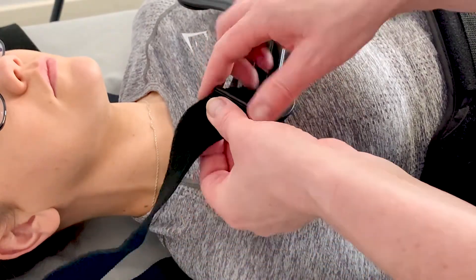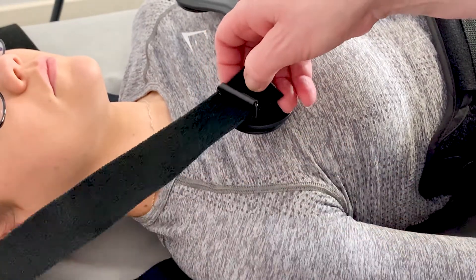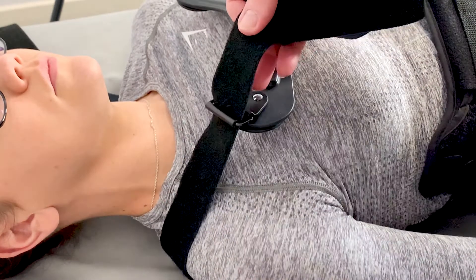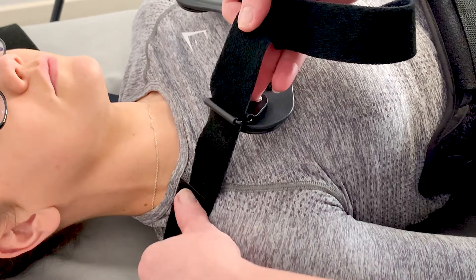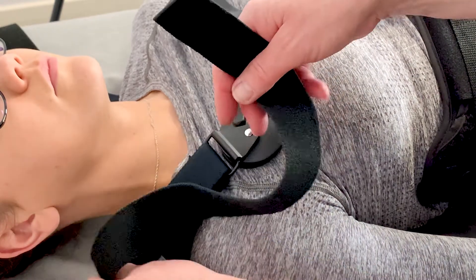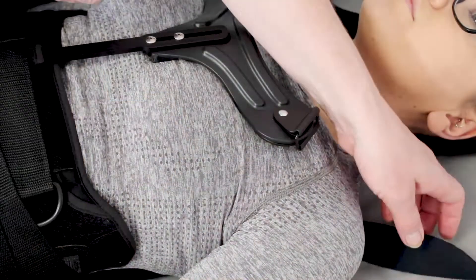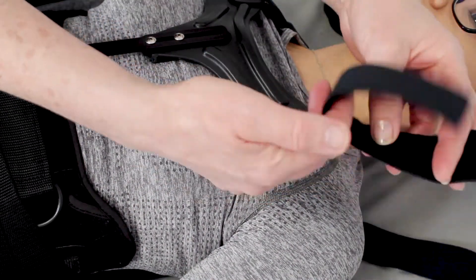Bring the straps from the back of the orthosis over the shoulders and through the metal fastener. Pull firm and fasten the hook back down on the loop section.